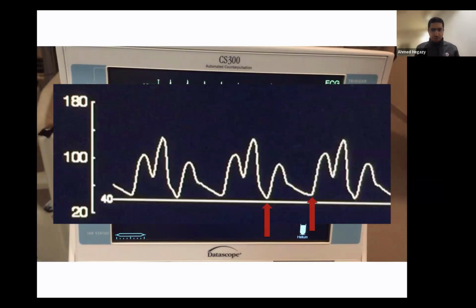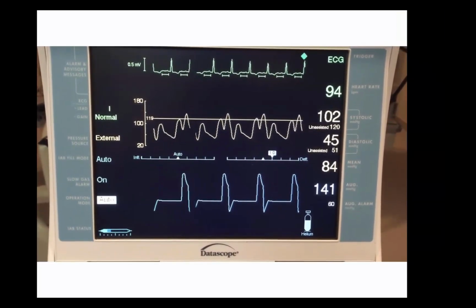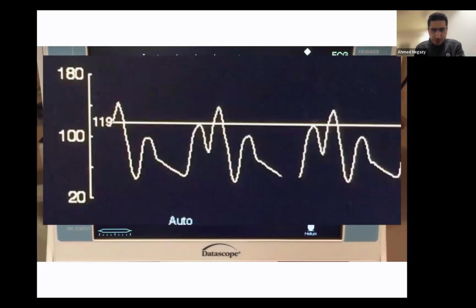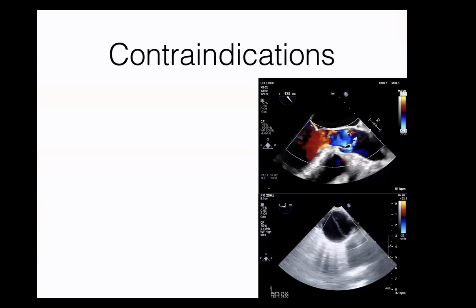Let's look at parameter number 3. You've moved your reference line up to the systole now to see how your augmented systolic compares to the native systolic. And it's very clear here, very clear, that the systolic right after the augmentation is lower than the native systolic. So here it's very clear. This is the native systolic. We have the reference line on the native systolic. The systolic right after augmentation is lower. So that tells me by all 3 parameters, this balloon pump is working very well. So now we have a balloon pump that's working by all 3 criteria.